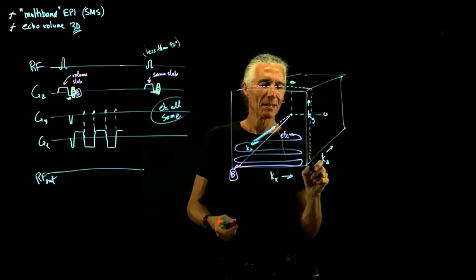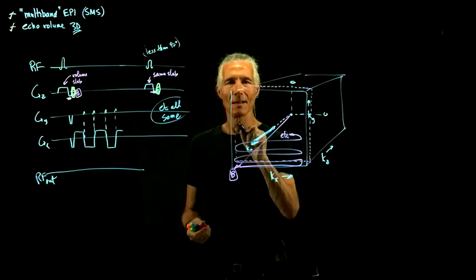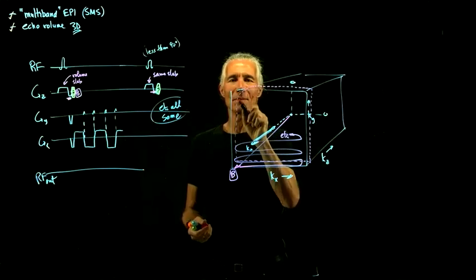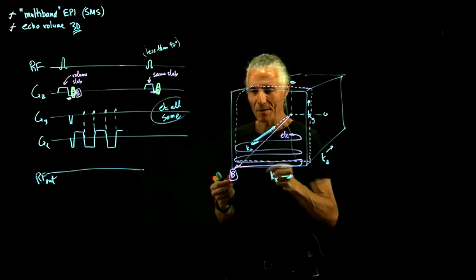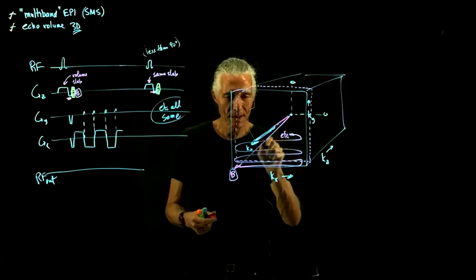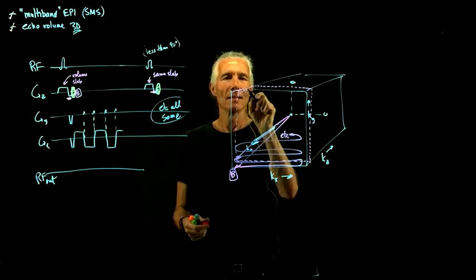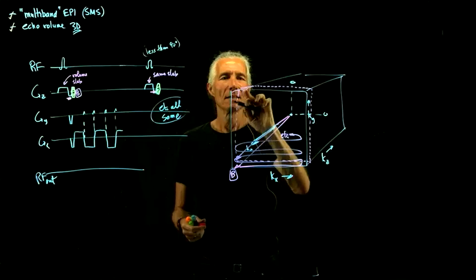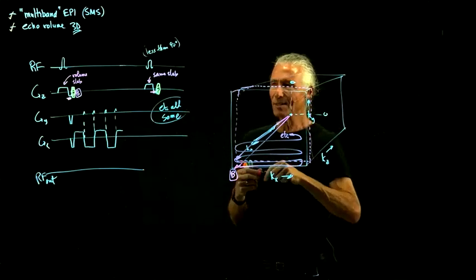So that's the next plane of k-space. Supposed to be up there, sorry. So that would then put us in our next plane of k-space, and then we would collect that next plane over. So we haven't done any slice yet.